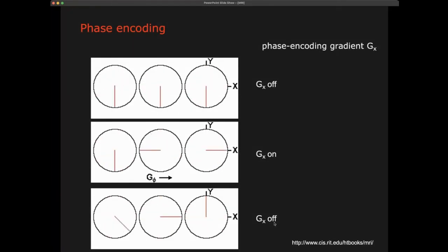The magnetic gradient changes along the X and Y axis or along the Z one? Because if it's the Z one, I don't understand. In the 3 directions, we will see that we will change that in the 3 directions. By changing it in the Z direction, we can do slice selection. By changing it in the XY, so actually, if you want to do a random oblique plane, of course, you need to do that with a combination of X, Y, and Z gradients. So you have them in all directions, actually.